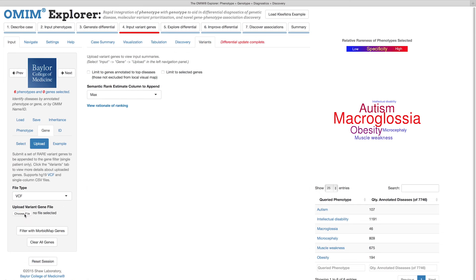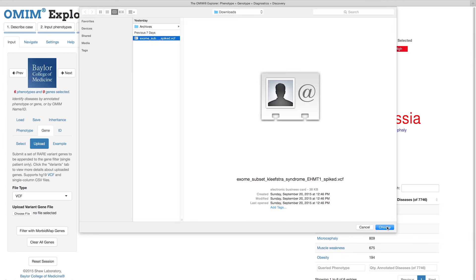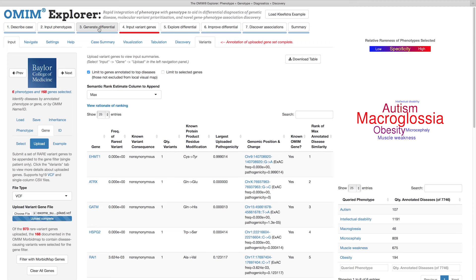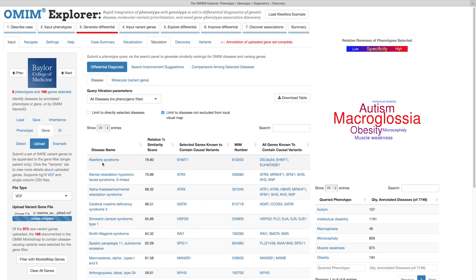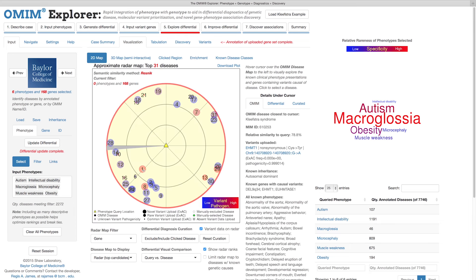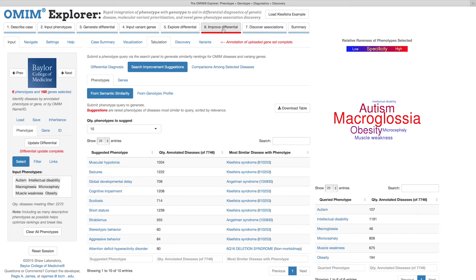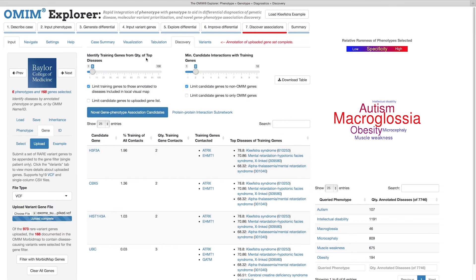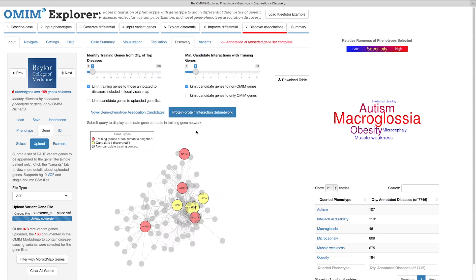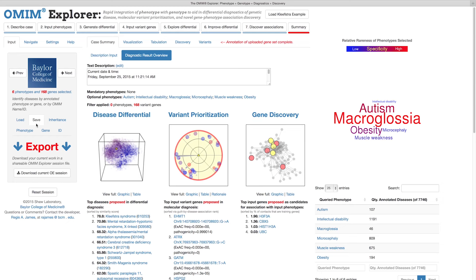The workflow also includes filtering the differential to diseases causally linked to genes variant in the case, using medical judgment to curate this differential with a detail-overlaid visual interface, further refining a complex differential through dynamically generated phenotype suggestions, considering novel disease gene discovery candidates through review of highly ranked genes with no known disease association, and saving work to resume later or to share with colleagues.